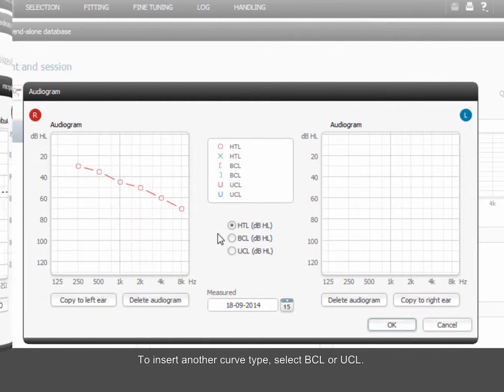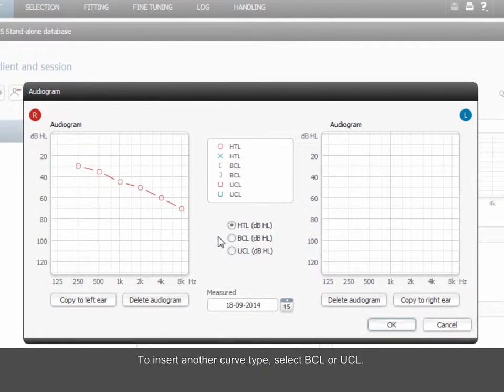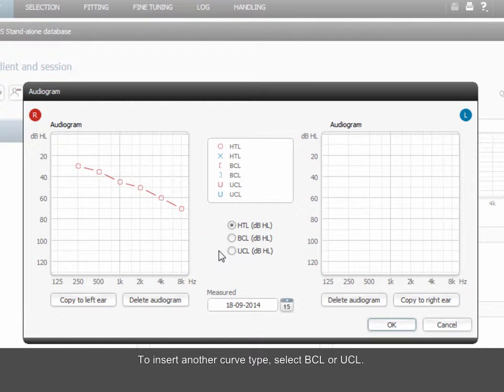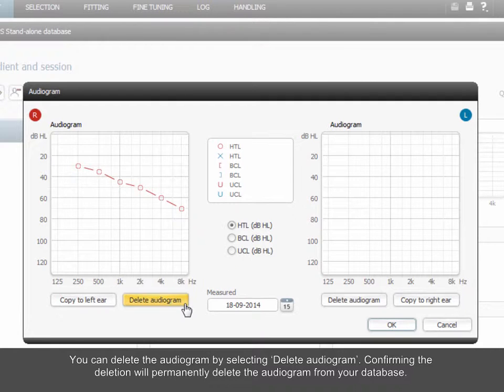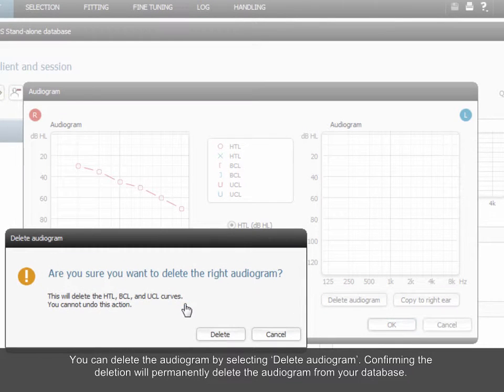To insert another curve type, select BCL or UCL. You can delete the audiogram by selecting Delete Audiogram. Confirming the deletion will permanently delete the audiogram from your database.